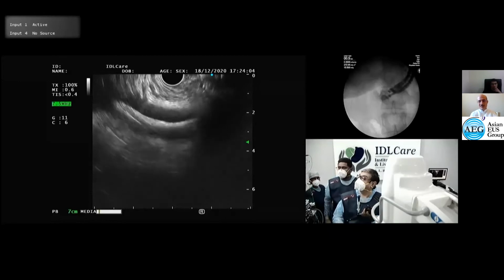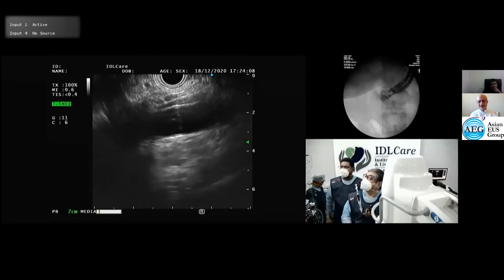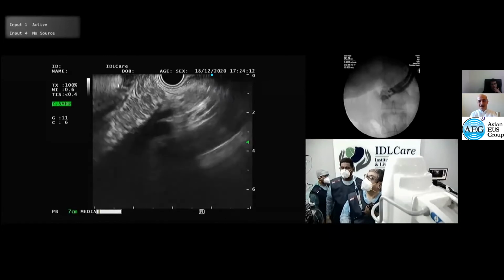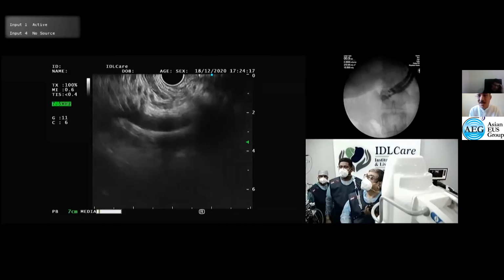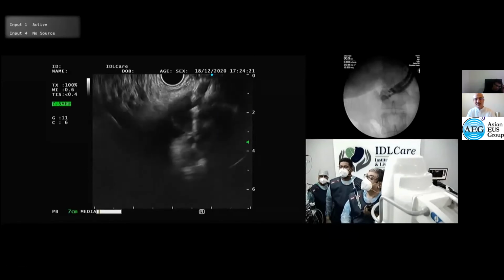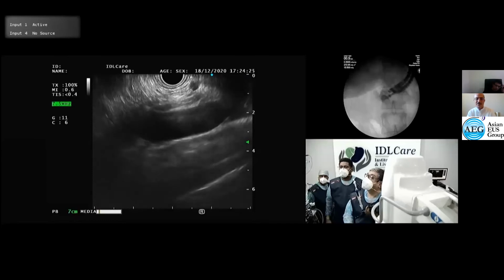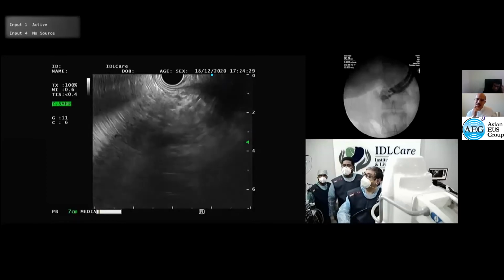I'm not really finding it a great position. You should normally see a nice, beautiful duct. Then only we should puncture. Otherwise, we'll go here and there. Chronic pancreatitis patients will have lots of vessels here and there. I don't want to cause problems. So one last attempt. Endoscope.